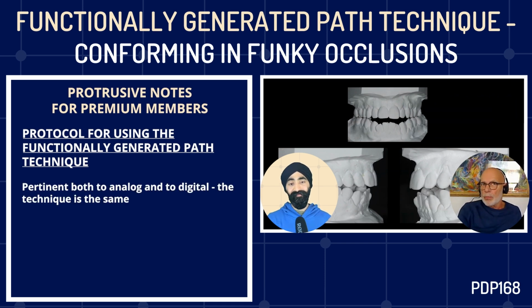So it's pertinent both to analog and to digital. The technique's exactly the same. It's just how you produce the final restorations that's different.